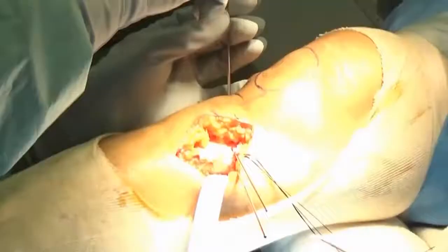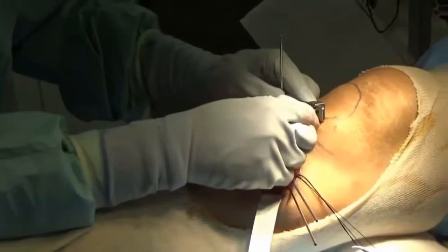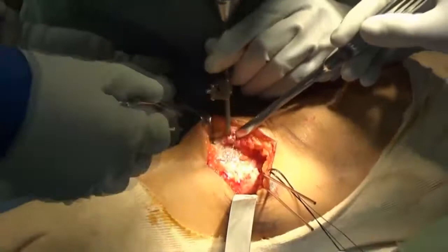Our custom-designed compass for arc osteotomy is then mounted on this short hinge pin and used to describe an arc with a radius of about 50 millimeters. A series of 2-millimeter dots is then drilled on the arc.